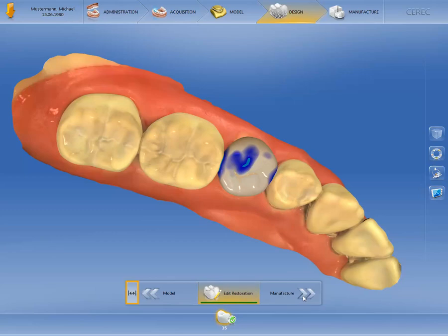By clicking on the small symbol on the left, all available steps can be shown and selected. The previously selected display is stored in the CEREC software and is automatically displayed in full for the next patient case.